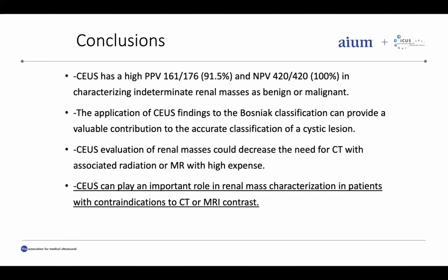We would like to see a large prospective study done so that we can get confirmation, so that in the future, maybe if we have a negative CEUS on a complicated cystic mass, follow-up may not be necessary, or at least not at the intervals we're doing now.